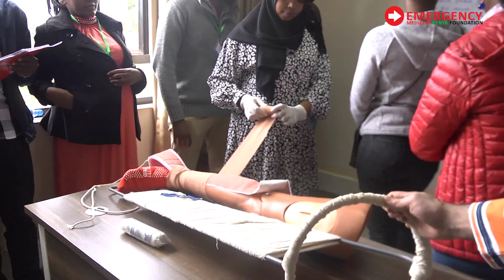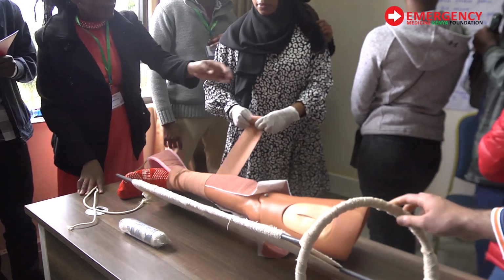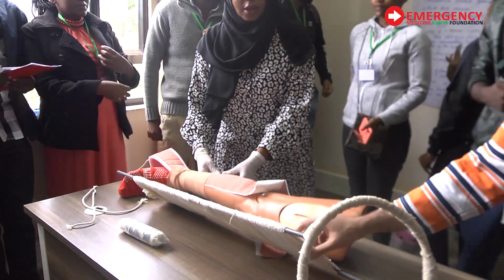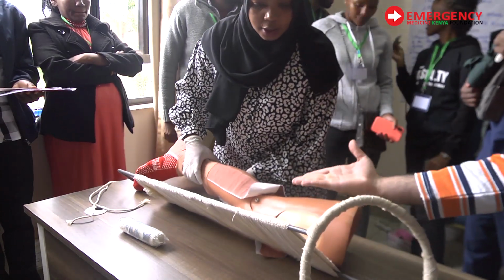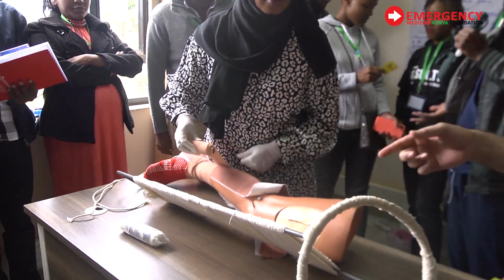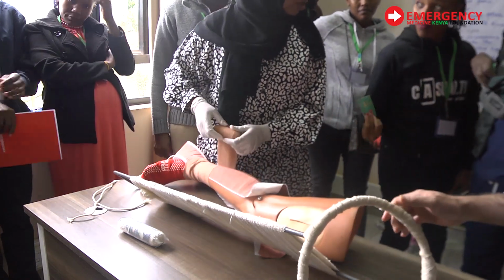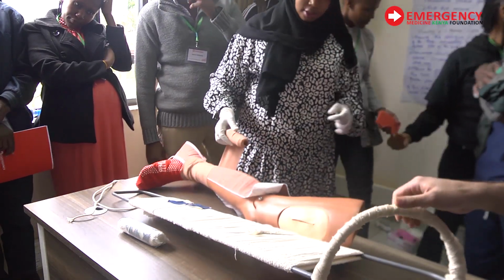This bandage is resting on it, right? It's necessary first to do that. You have to, this one, yes. Most of the time it comes like that. Oh, okay, thanks.